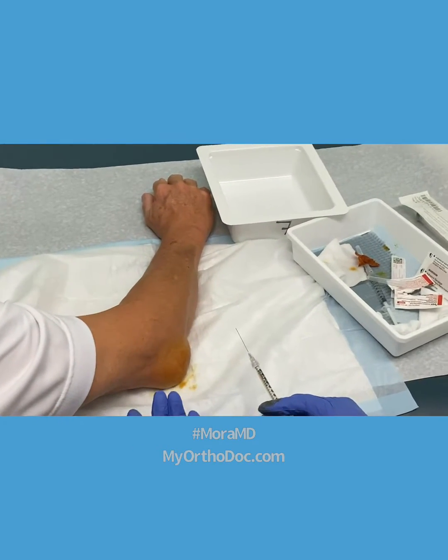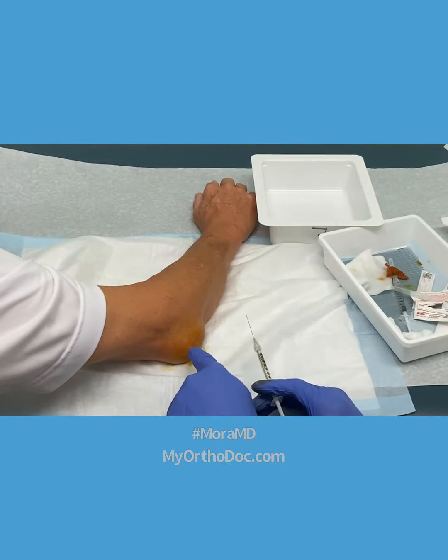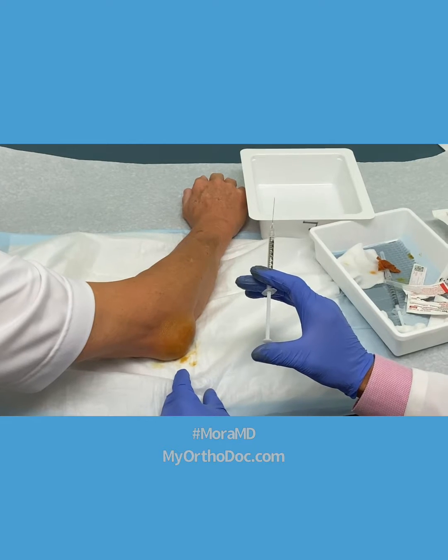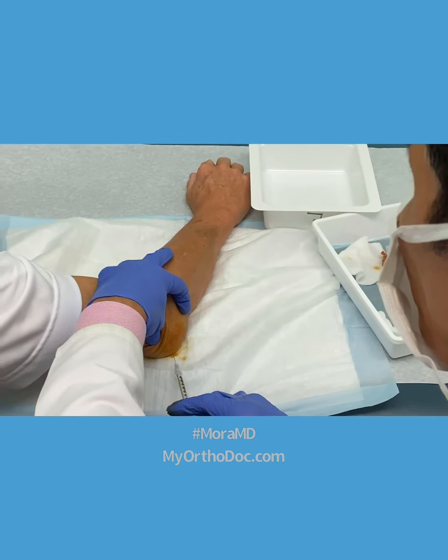I'm going to expect most likely blood. I already added alcohol and betadine. This area usually doesn't hurt. I'm going to give you a little lidocaine injection. I'm going to just give a little injection here — a little baby poke.